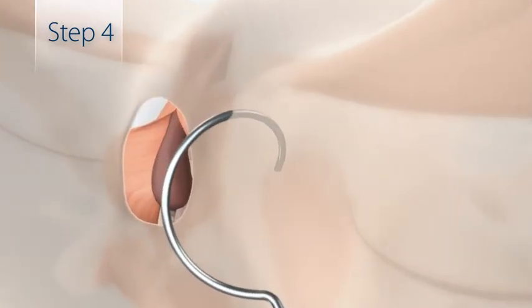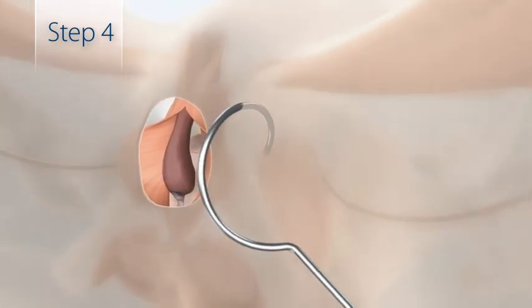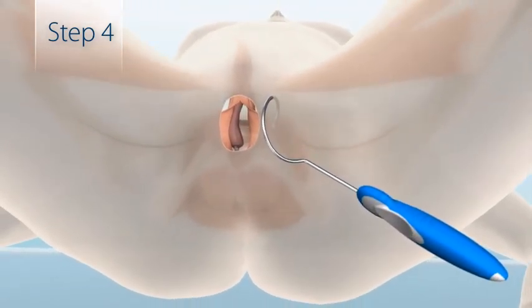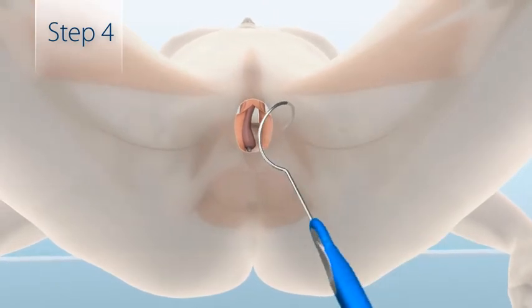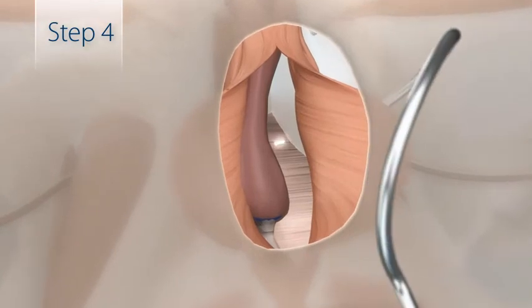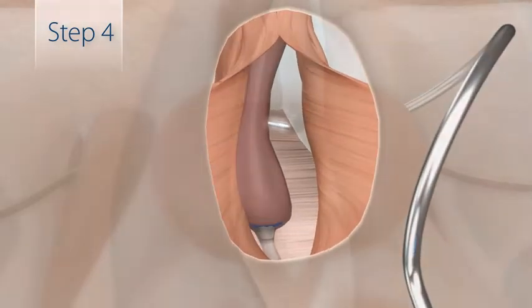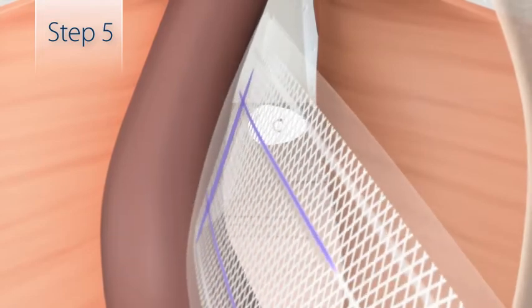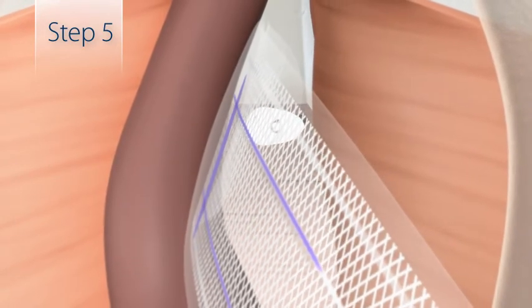After 2 pops are felt, stop advancing the needle and drop the needle handle toward the midline to align the needle path. Rotate the needle until the tip meets your finger, and bring the needle tip high into the perineal incision. After passing the needle, connect the sling by pressing the white connector onto the needle tip until it clicks into place. Make sure the sutures are facing away from the urethra.